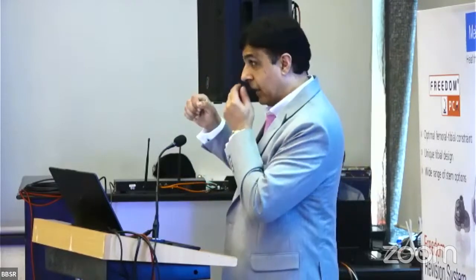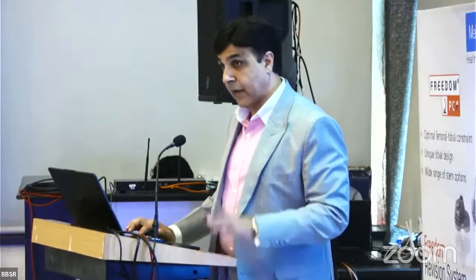There was extensive osteolysis. And this picture you see very commonly with the old knees, where you have a CoCr femur and the titanium tibia. So the patients don't get a revision done, the poly wears off, and then the CoCr is rubbing against those titanium base plates. And what you have is a huge amount of metallosis and a fractured structure. So she had a periprosthetic patella fracture. Quadriceps mechanism was intact. Since the quadriceps was intact, it's only the fracture of the patella that has to be dealt with. So your treatment modality changes.